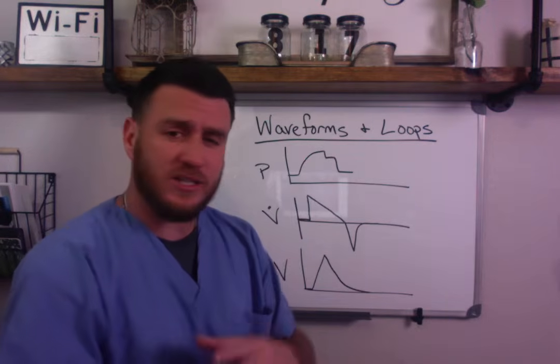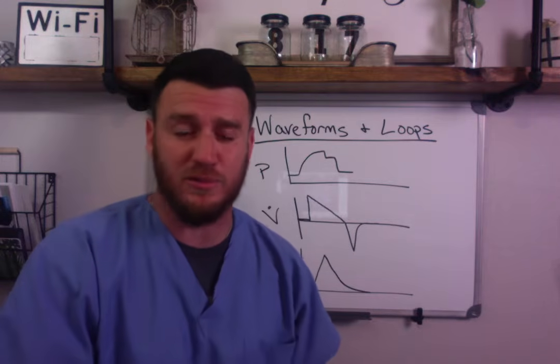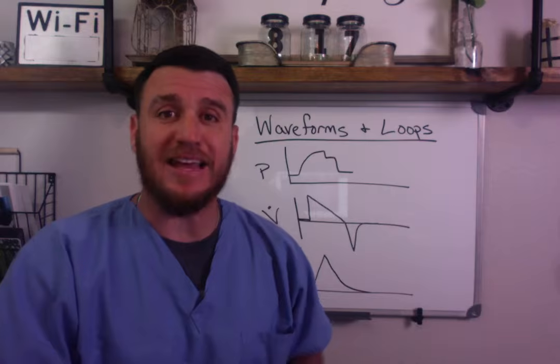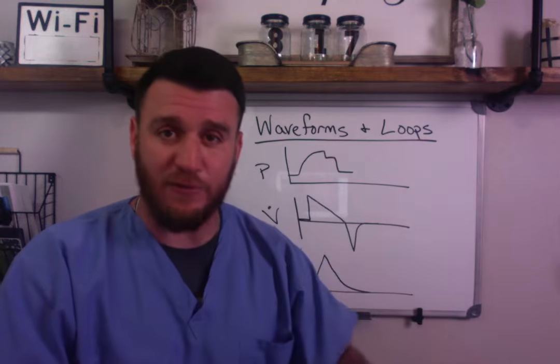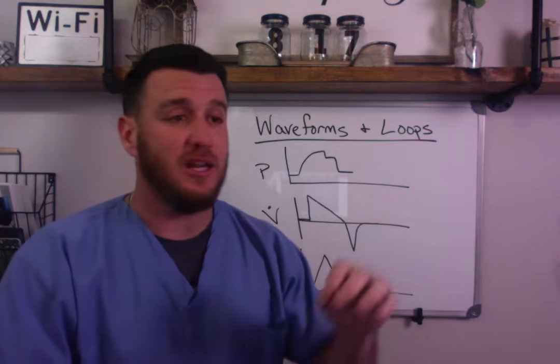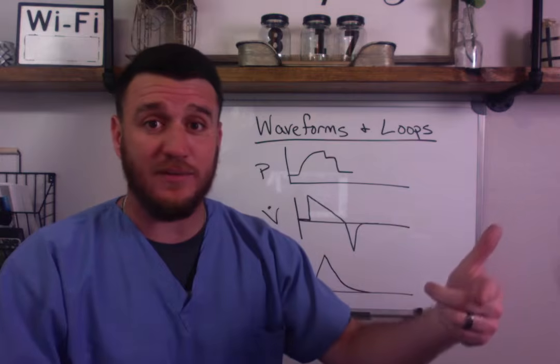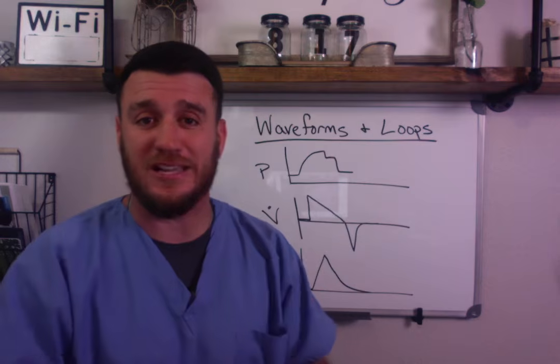Okay? So what we're talking about are waveforms and loops. And before we get into actually breaking down the waveforms and loops, what I want to do is tell you that waveforms and loops is one aspect of respiratory therapy that separates the superior respiratory therapist from the average respiratory therapist. If you're going in and you're writing down numbers and you're not assessing your waveforms and your loops, then guess what? You're an average respiratory therapist. Now you can change that. You just got to start looking at this stuff. But to look at it, you have to understand what it's telling you about your patient.